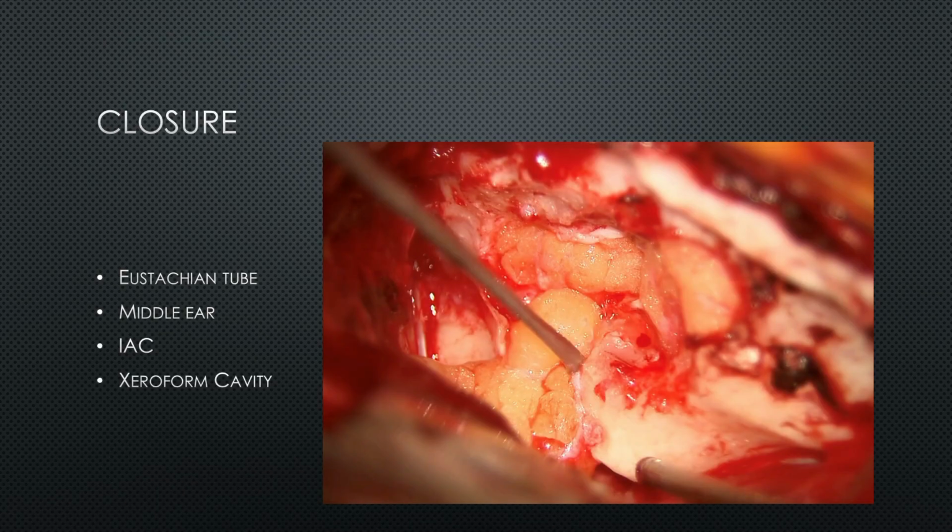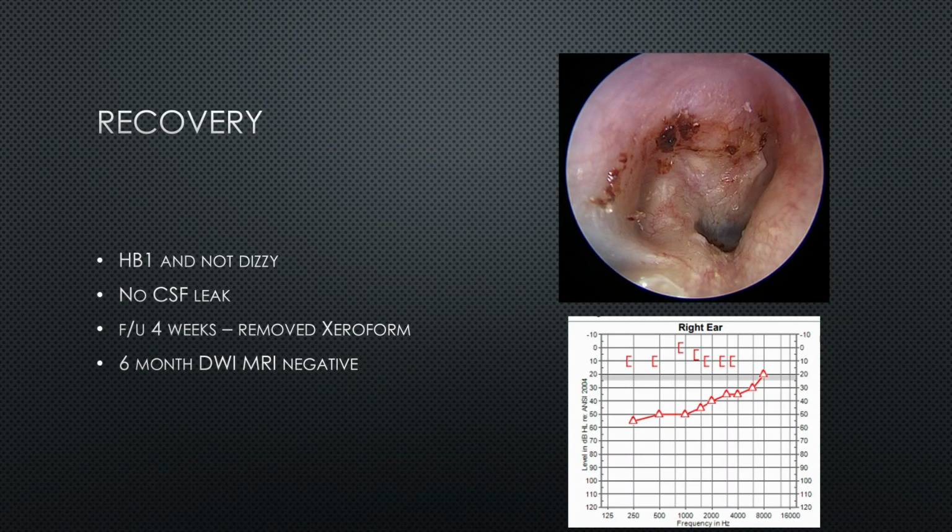And the last thing I want to do is open up the craniotomy again and repack all this. So I'm trying to figure out how can I pack this cavity, because if I push on it, I push the fat back or the leak stops. And the resident's like, well, how about just using Xeroform? I was like, oh, brilliant idea. So I packed it with Xeroform very tightly. She didn't leak in the clinic, and didn't leak post-operatively, and remarkably, did well. Her hearing is her hearing. Her bone line is unchanged, which makes no sense. But the reality is we get away with stuff that we shouldn't get away with sometimes.